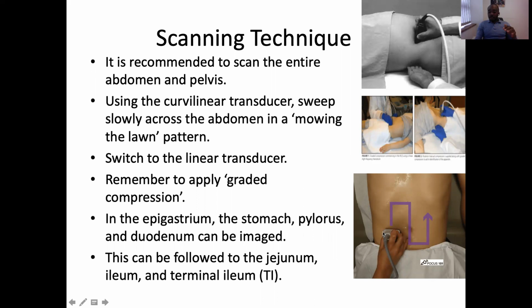So once you identify that, the cecum will just be next to it, to the patient's right, and just around there, in the ileocecal region, you find the appendix hanging somewhere there. So it's always important, after you've checked everywhere, to come around and take your time on the right side to be able to visualize those important bowel ultrasound landmarks, which are the terminal ileum, the cecum, and the appendix.